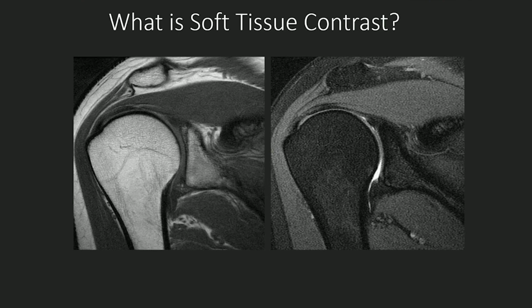In terms of using planes, it's sort of a tricky question, because in general, whether or not MRIs perform these planes or include these planes when you order a study, the answer is a general yes, but it's important to know where MRI protocols are designed. MRI protocols for musculoskeletal imaging are typically designed by the responsible musculoskeletal radiologist. If there's no musculoskeletal radiologist, then a general radiologist may do it, or they may copy it from articles or copy those protocols from institutions. Most protocols in general have three planes.